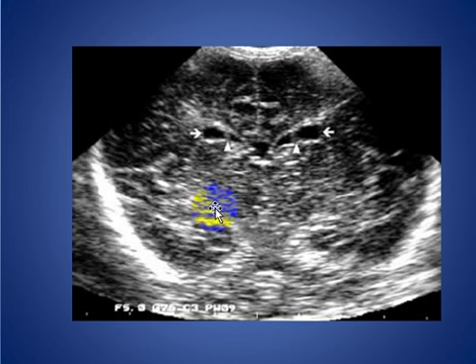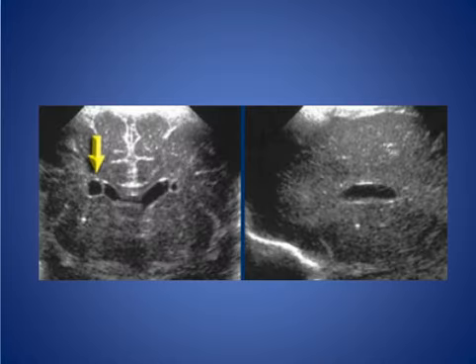Here we see a neonatal patient with ultrasound, and we see an echoic line in the frontal horns representing the coarctation, and we should not mistake it for a periventricular cyst.